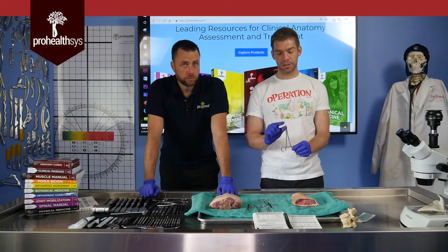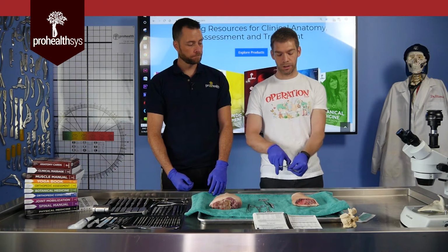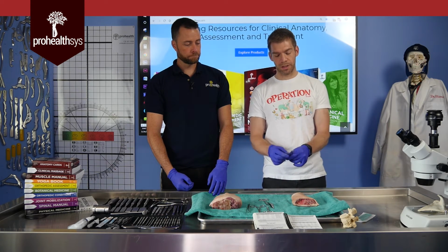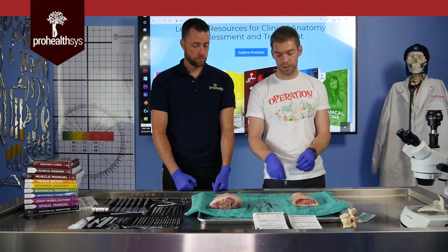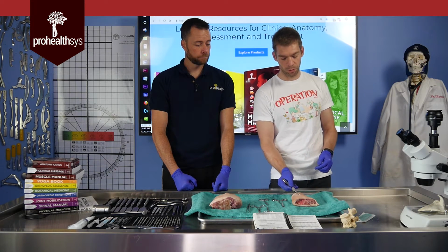These are like hemostats, except the jaws are much shorter. They're very strong. They click and lock, click and lock. And since the jaws are so short, it gives you a lot of leverage to hang on to the needle that's attached to your suture material, your thread. So, needle drivers.